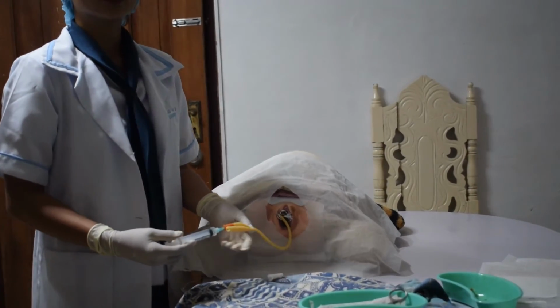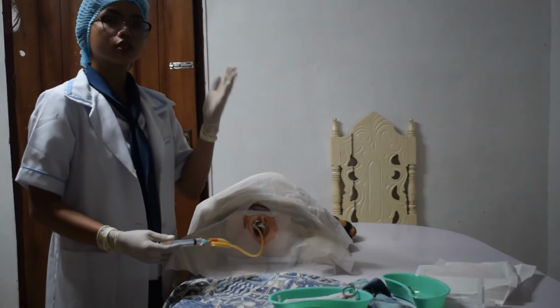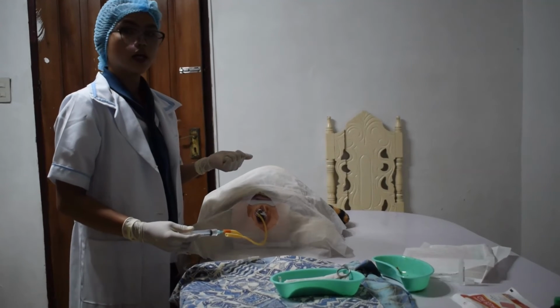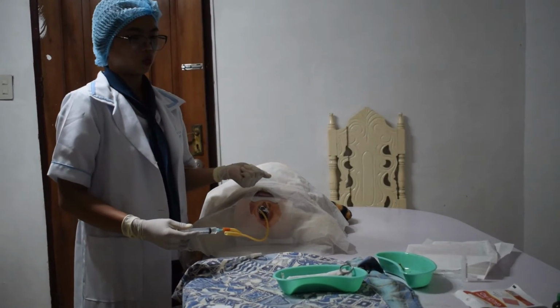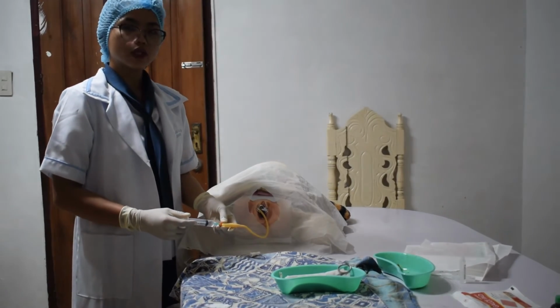If the client complains of discomfort, immediately withdraw the instilled fluid. Advance the catheter further and attempt to inflate the balloon again. Remove the syringe.